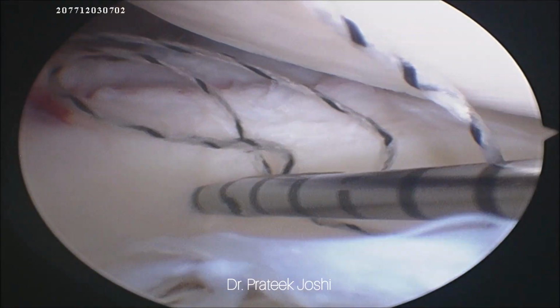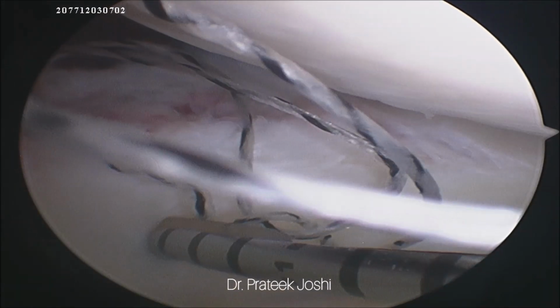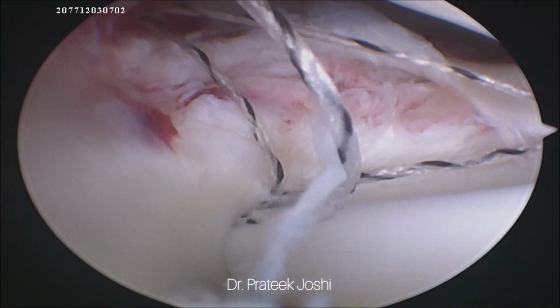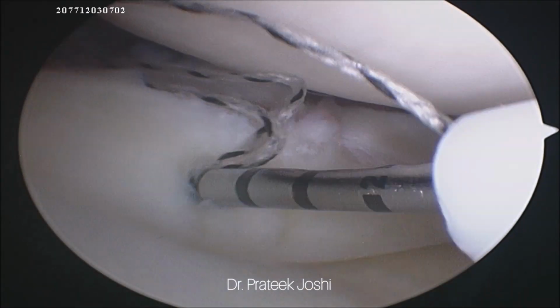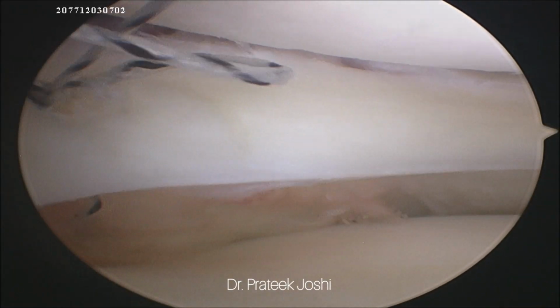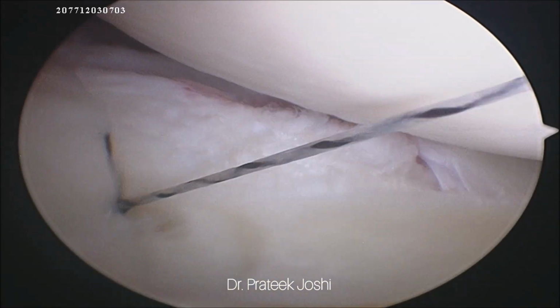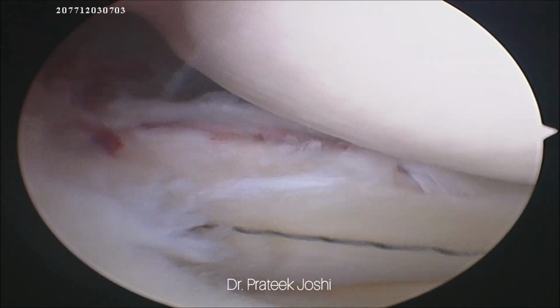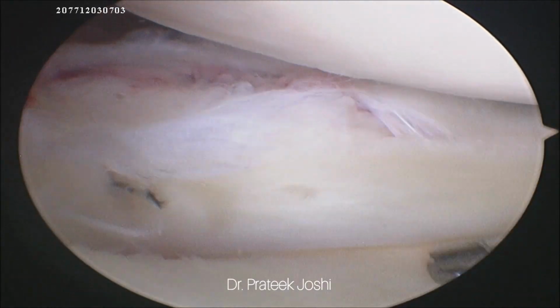So as you can see, I have changed my viewing portal from the anterolateral to the anteromedial portal, and now I have inserted my all inside device from the anterolateral portal. And after taking the first bite from the superior capsule and the second bite from the substance of the meniscus, I am going to pull the thread in order to tighten the knot, and this reduces the tear quite nicely. And this is the medial most knot that we are going to take.